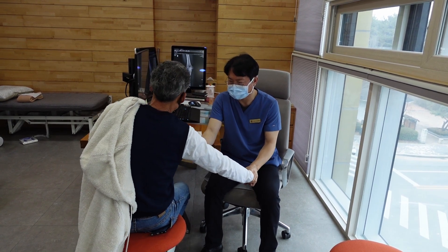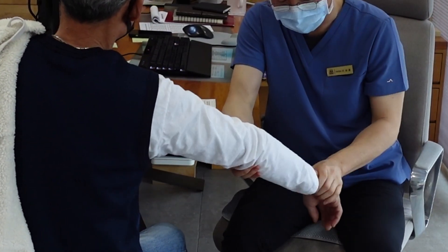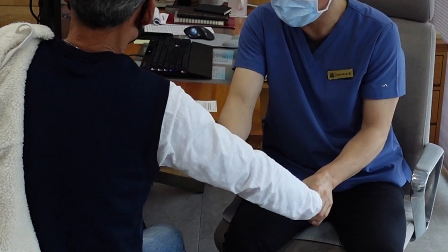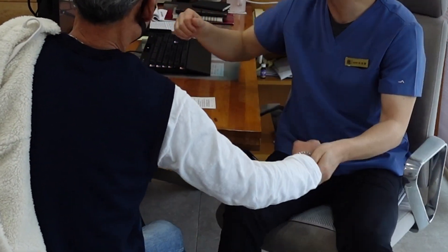During these tests, you will likely observe the patient's pain response through their body language, particularly when I execute the extend and flex movements and the wrist-resisted test.